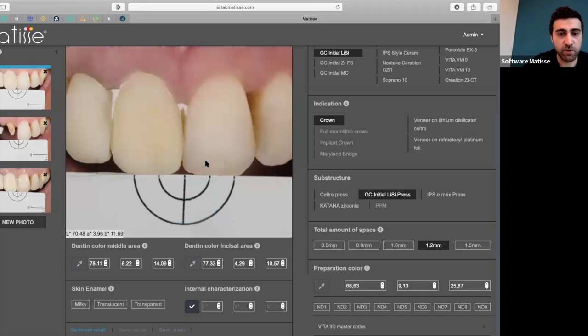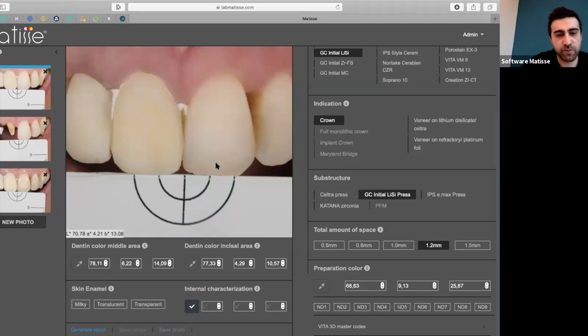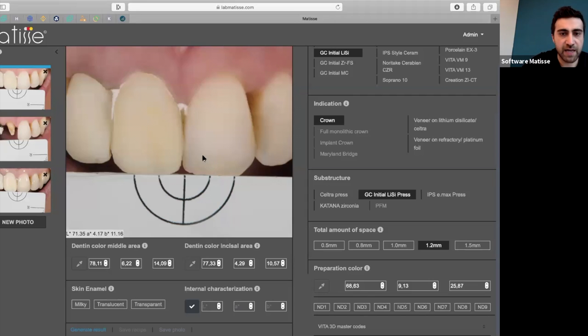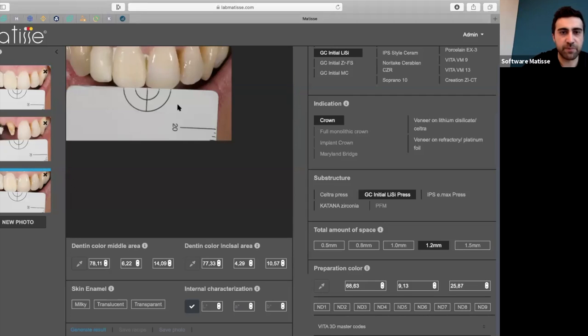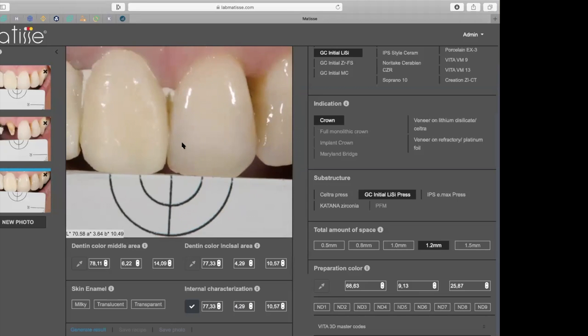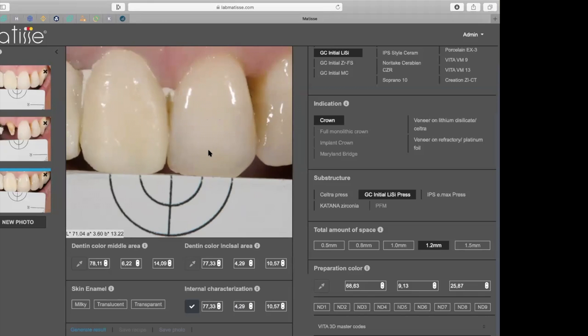So when you see this kind of warm discoloration, you have to make sure that you don't measure on the incisal edge or in the middle. You have to find the transition area. For example, in this image you can see it better. We have here the bright zone, right? So the transition zone is around here.